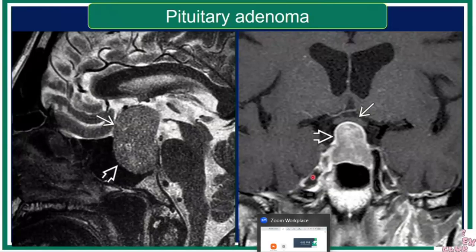So my question has to do with other MRI protocols that may help us. We only need to know about small tumors when they secrete ACTH and cause Cushing's disease. For the remainder, we're not that concerned because these are benign tumors with very slow growth.